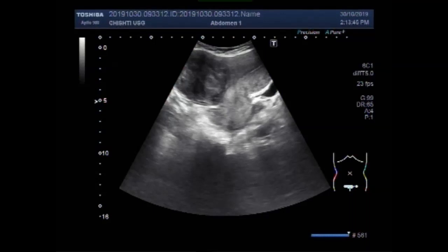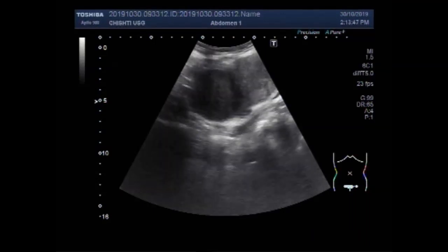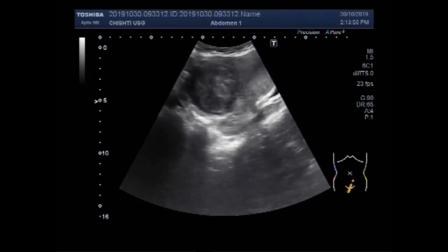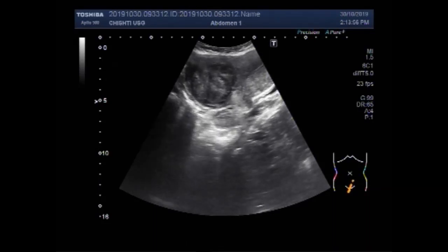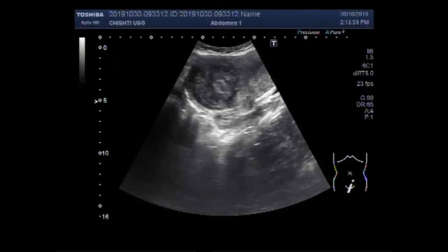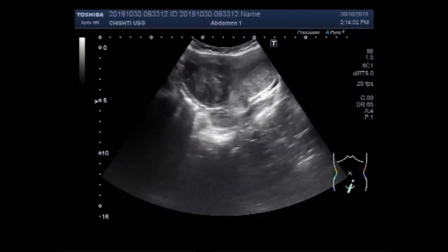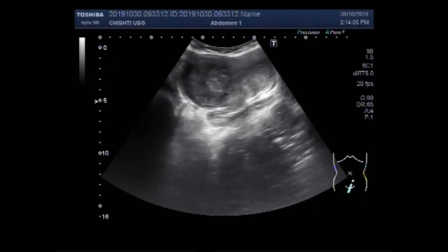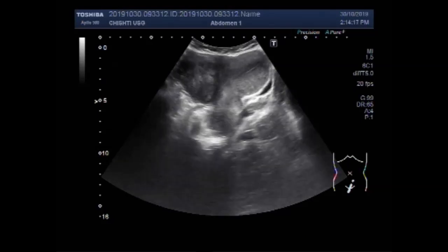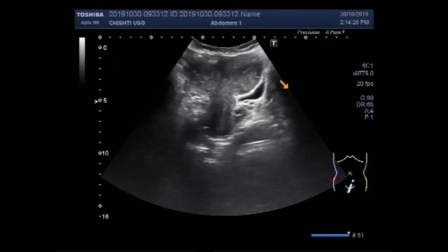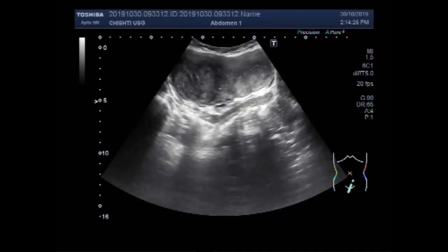Dear viewers, I hope you are all fine. This ultrasound video — in fact two videos — shows fibroid uterus. This is the first video, and you can see the uterus and a large fibroid along the posterior wall of the uterus. This is the uterus, this one is the fibroid, and this is the urinary bladder.